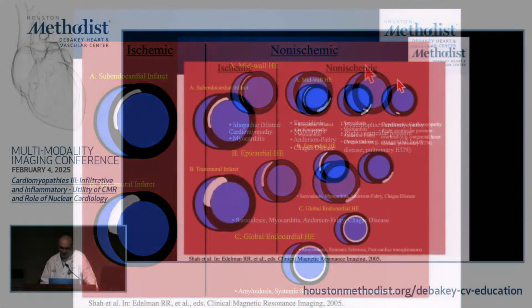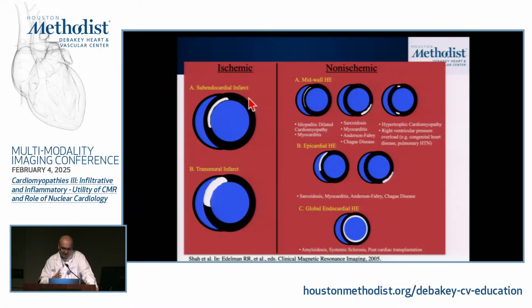So again, to wrap up, what I think hopefully we showed over the previous lecture as well as today's lecture is that this ability with delayed enhancement MRI to directly look at the myocardium and identify myocardial tissue damage can be very useful. We know in the ischemic setting where we're looking at myocardial infarction, this technique can be useful to identify a subendocardial or a transmural infarction and the extent of the infarction, and that seems to be associated with likelihood of recovery of function after revascularization.